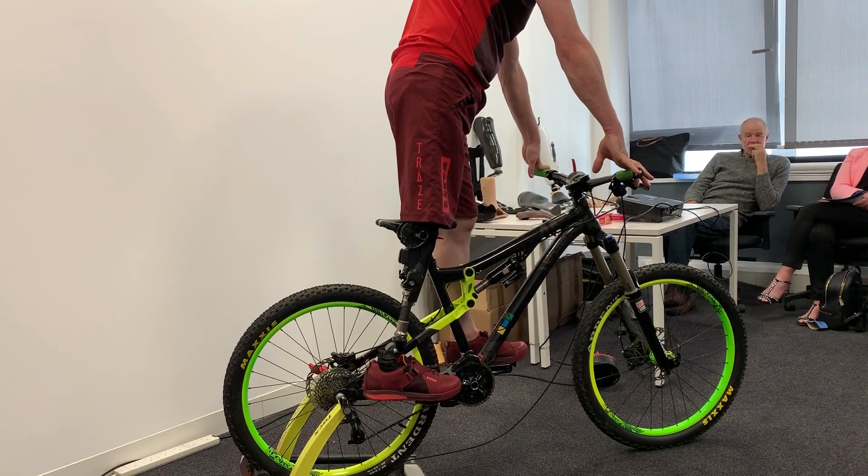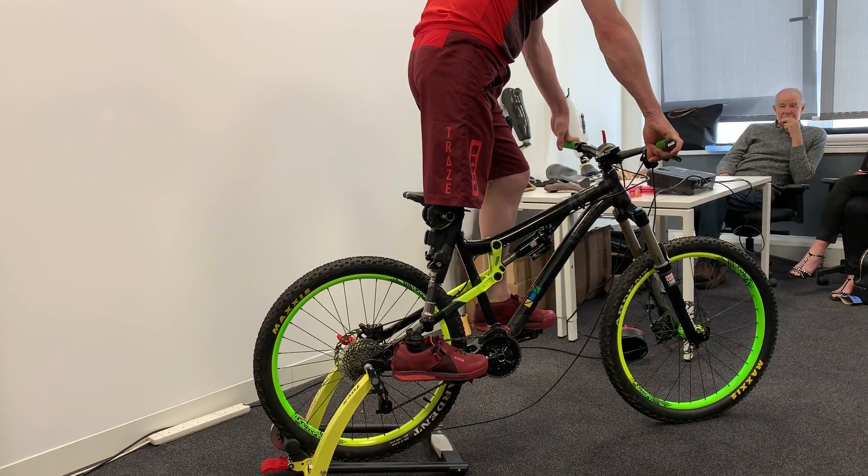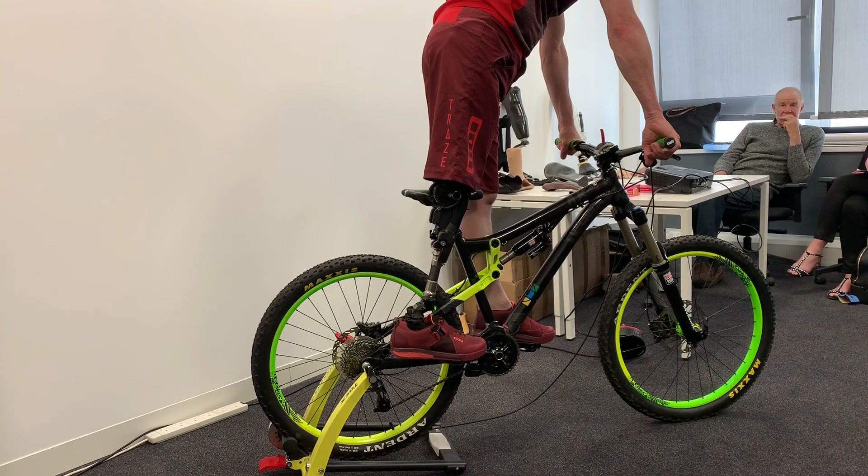I wouldn't be able to do that with a hydraulic knee because I'd have no support — it would fall, I'd fall off the back of the bike, or it would lock out in that position. And then the next pedal stroke, if I couldn't bend my leg — and it's happened before — it throws you over the handlebars because my leg wouldn't go.